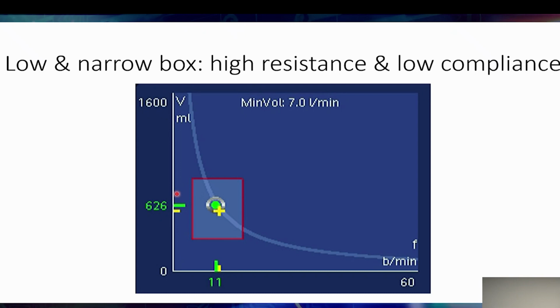This is the suckiest one. What happened here? What is this? What disease process is this? This is ARDS. So it's really stiff lungs, and they need to ventilate. Okay, you need perfect timing for their ventilation as well. They have a lot of mucus, they have a lot of obstruction, a lot of issues. You're trying to basically match it up, and that's all that is.